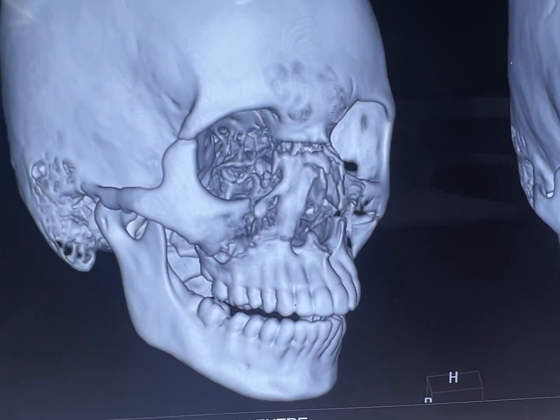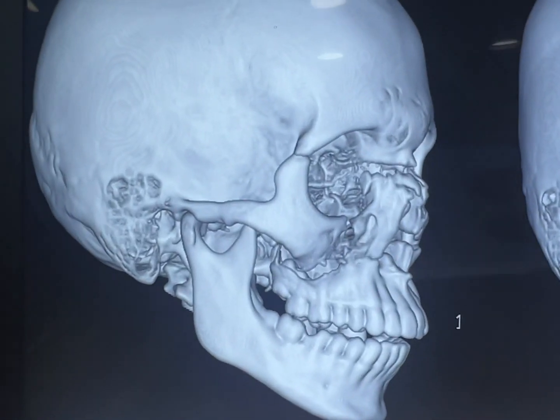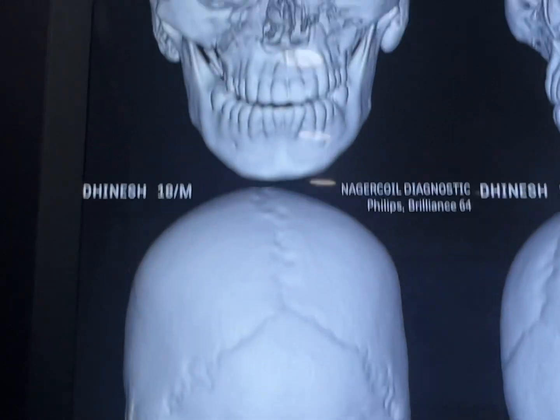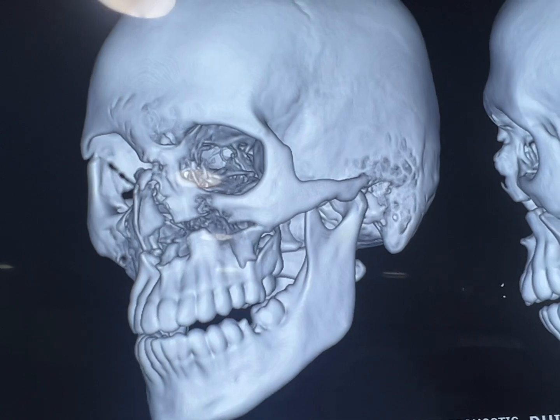What you're seeing here is a Le Fort I and Le Fort II with nasal bone fracture. We're going to be doing open reduction and internal fixation.